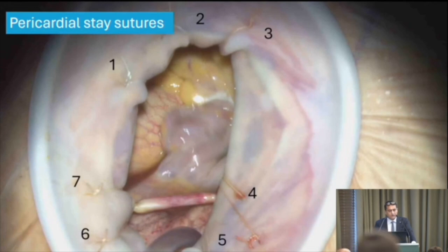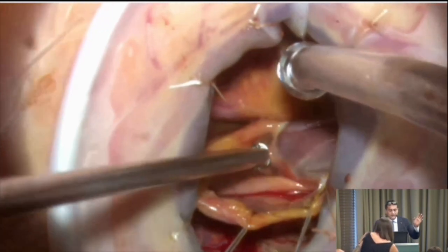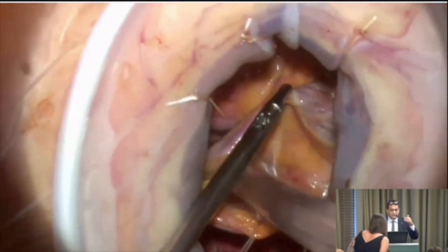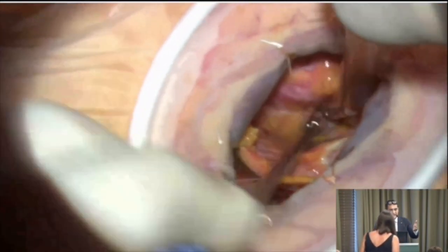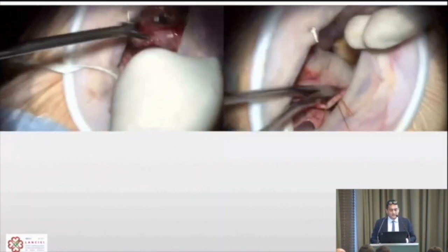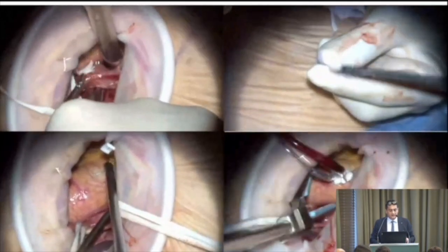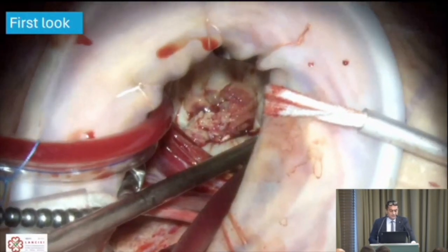We apply three anterior and four posterior pericardial stay sutures — the right atrium is almost touching the chest wall and the aorta is well positioned. Entering in front of the right superior pulmonary vein puts you equidistant from the superior vena cava, the inferior vena cava, the right atrium, the mitral valve, the aorta, and the transverse sinus. Snaring the venae cavae, placing the aortic needle, and aortic clamping all become straightforward.